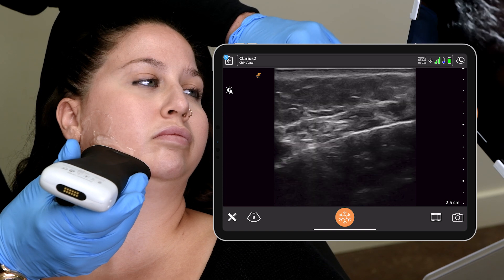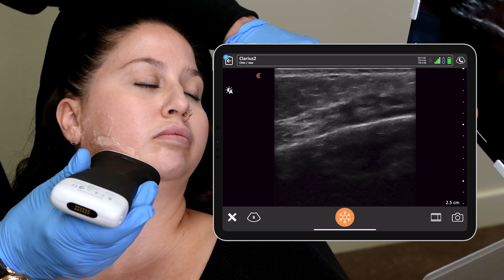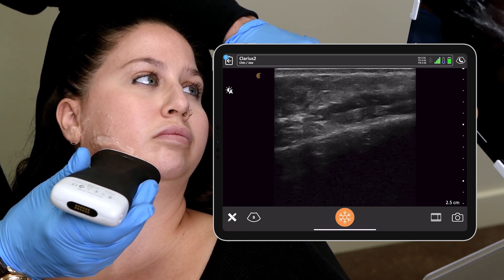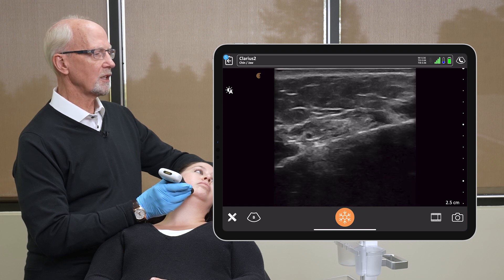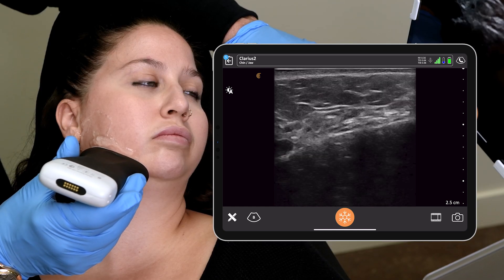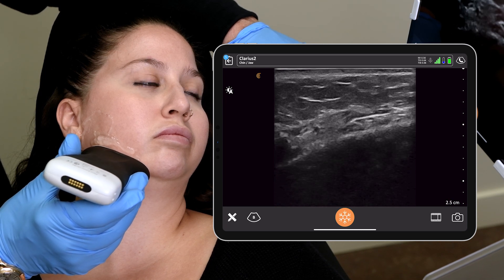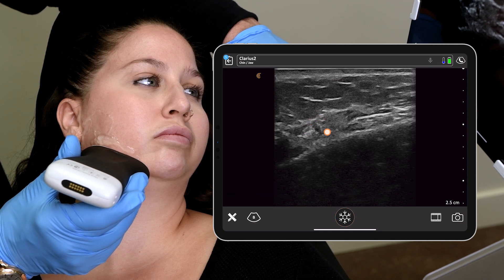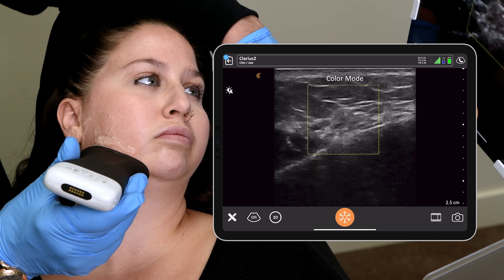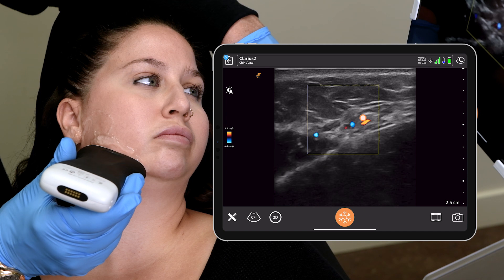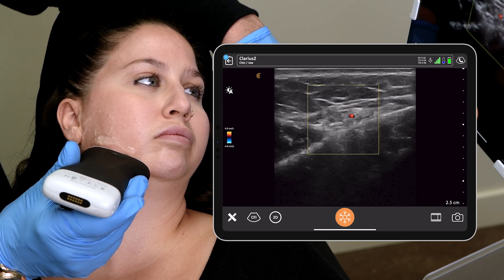We're going to move forward to the mid third of the mandible, going from the anterior edge of the masseter to where we start seeing the platysma, the DAO, and the DLI — basically where the mandibular ligament would be, as these structures fuse together on the mandible. You can tilt your device, increase or decrease gain, to get better clarity of what's happening here. Then freeze — you can see this little circular anechoic area, a little hollow, which is the facial vein. Going to color mode, we see the facial vein, which you can clear by pressing on it, but the facial artery doesn't clear when you press on it. That's a really good way to differentiate those two structures.